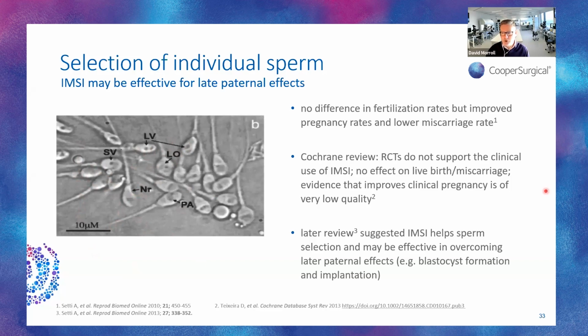The same group produced two systematic reviews, with the later one suggesting that actually sperm selection in selected patients can help overcome late paternal effects, so blastocyst formation and implantation. So there's still a role for IMSI if you look for targeted groups.